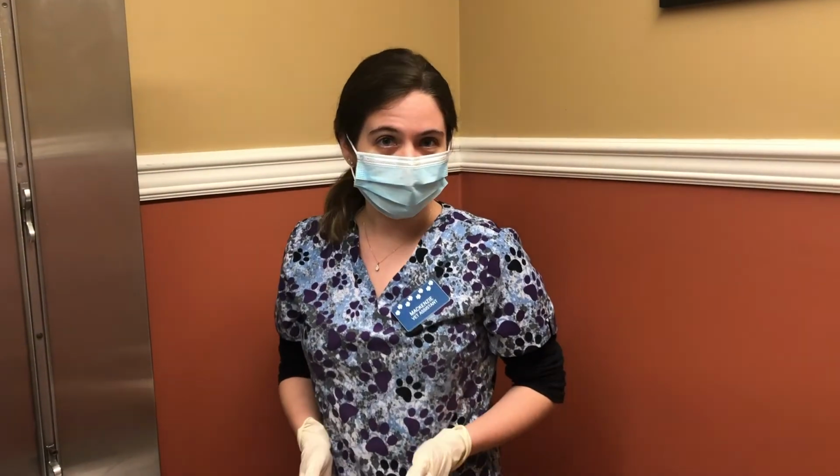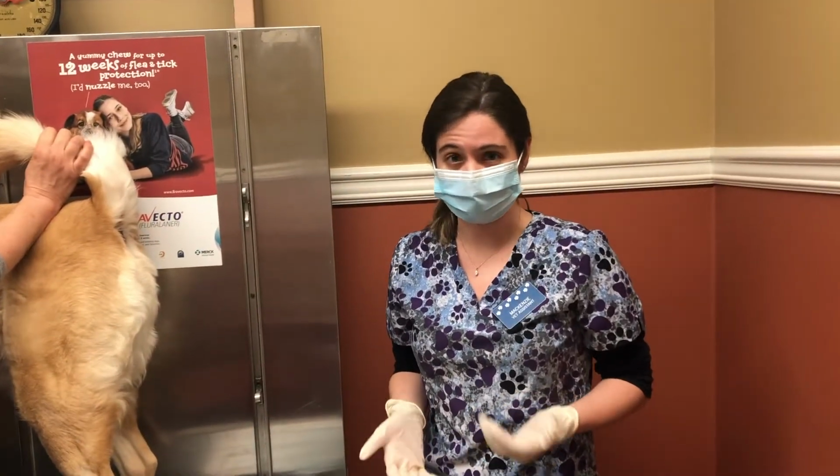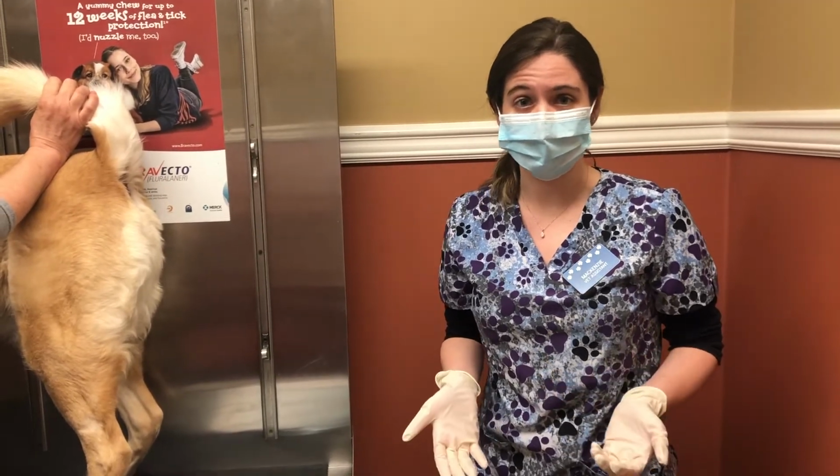So in this video, I'm going to demonstrate how to perform a vaginal cytology. Vaginal cytologies are useful in determining the stage of estrus that a female dog is currently in. It's also helpful in determining if an infection is present.